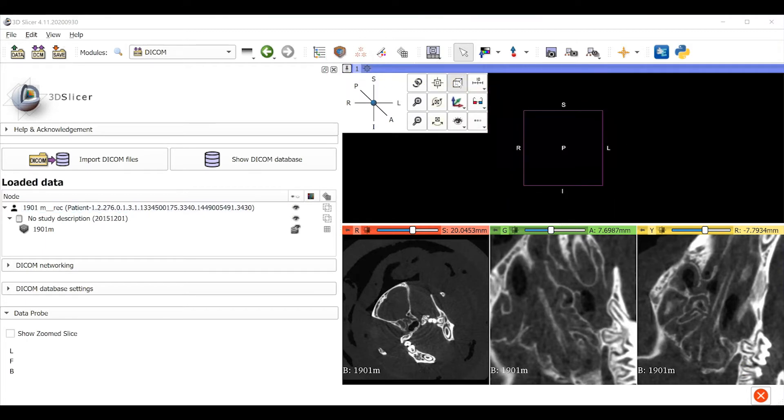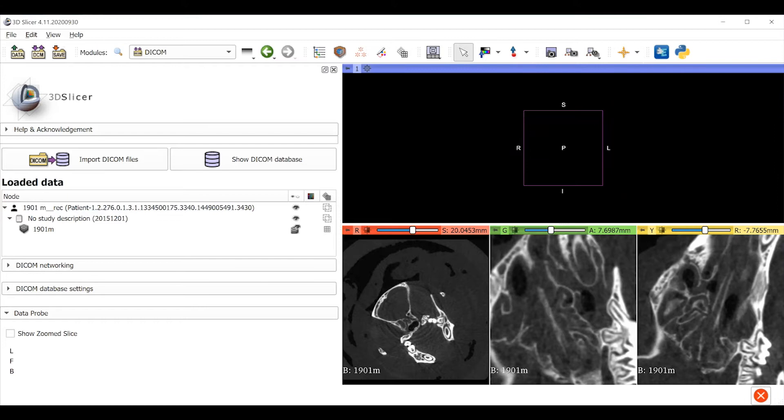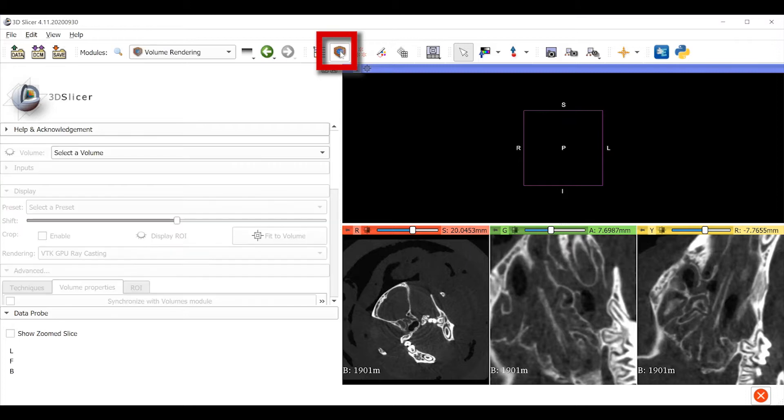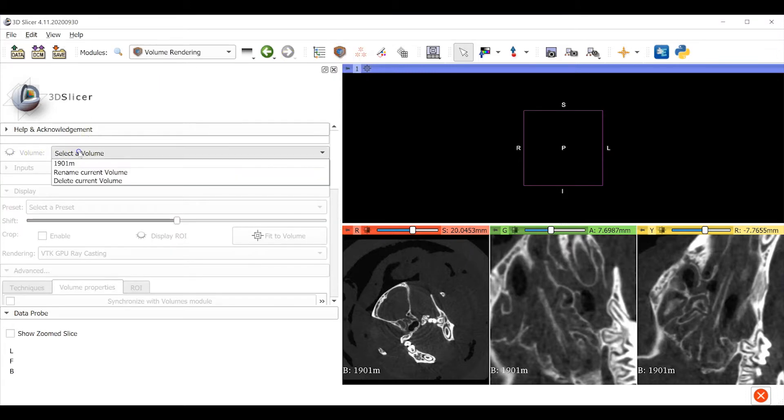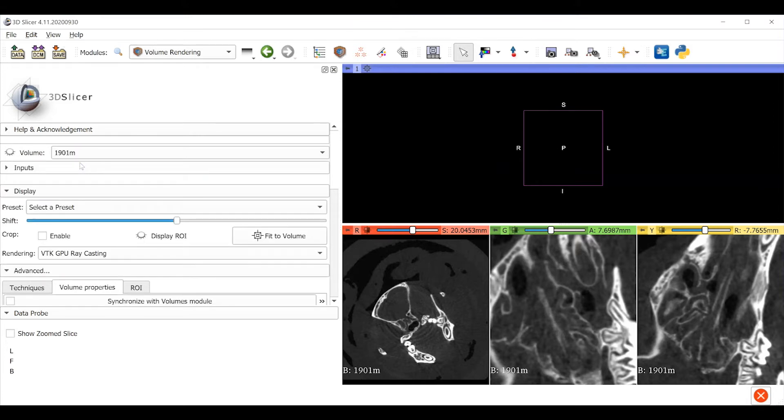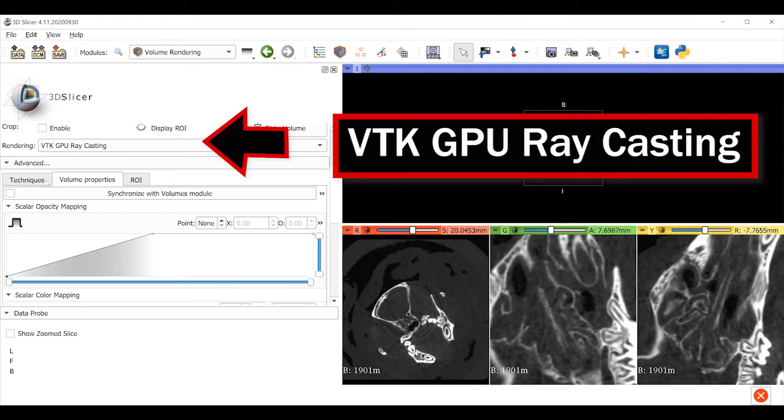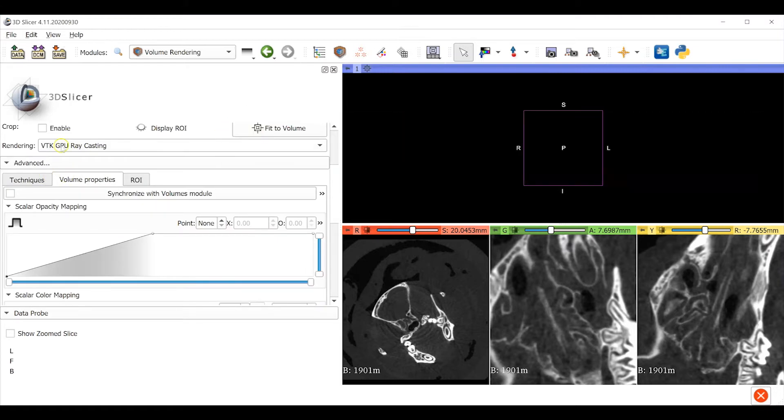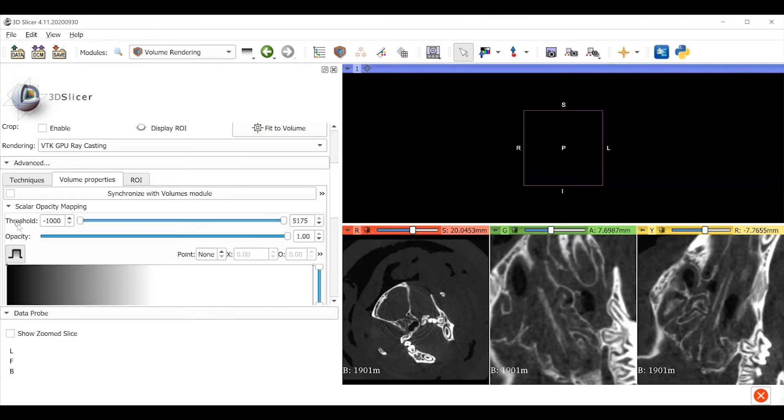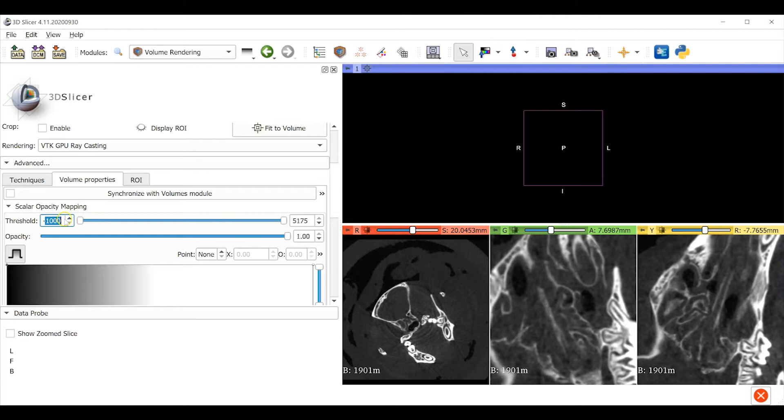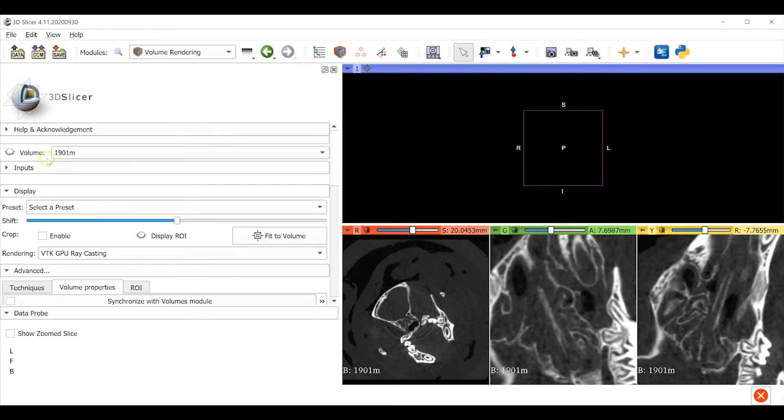The last step to set up our workspace is to create a volume render to visualize the bone of the skull. I do this last because it sucks up a lot of memory. Use the volume render module, select the data object that you want to visualize, confirm that the GPU ray casting is activated, and then under the advanced menu click the histogram icon, and enter the threshold value that represents the density of bone. So for this particular scan, which used Hounsfield units, I was about 300. I'll link another video below that will go into more detail on volume rendering, including changing the color of the model.